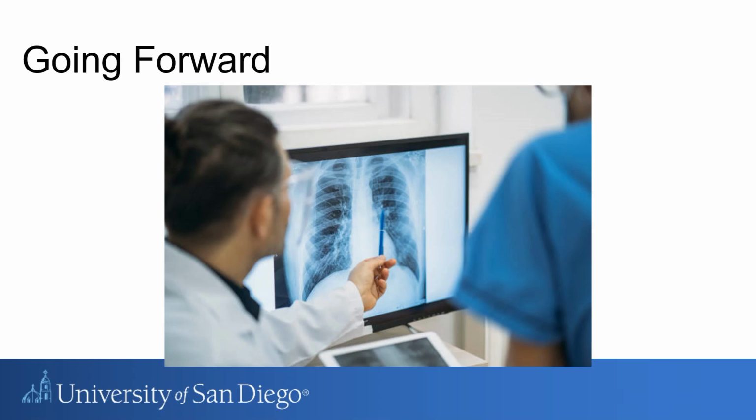We'd also probably improve label quality with manual audit or even semi-supervised refinement, probably with medical professionals like radiologists. And we'd develop a clinician-facing prototype with a review flag system for high recall alerts. Basically, that just means that if we find any real issues where it's flagging things way too high or completely missing conditions, there would be a human-in-the-loop kind of feedback.